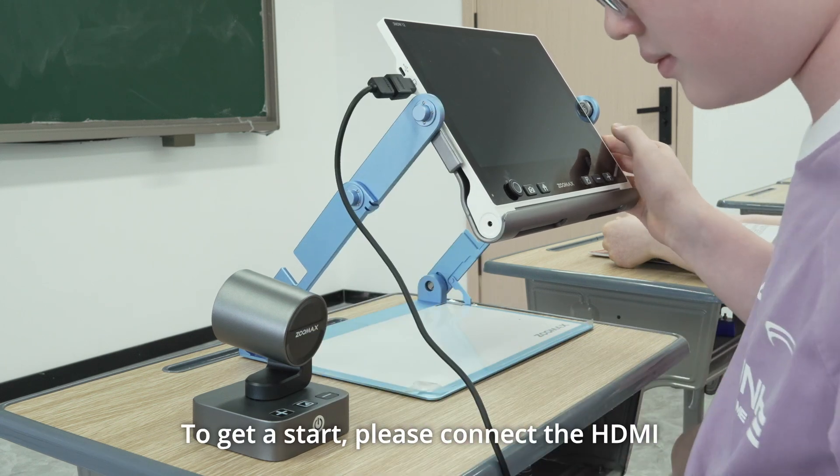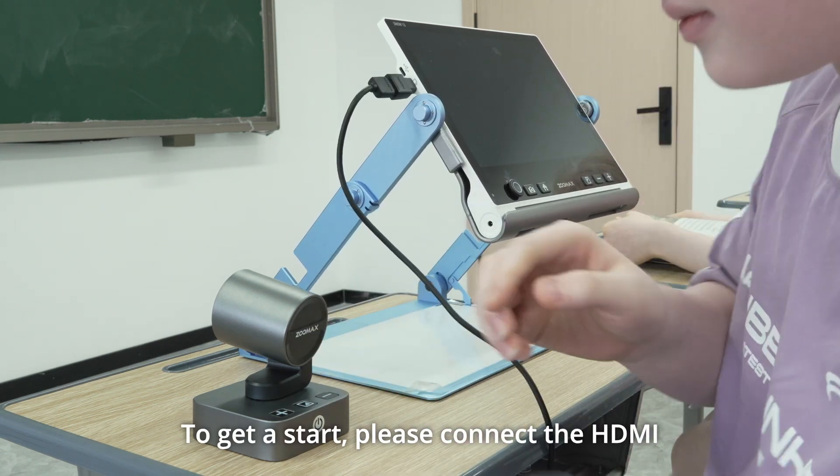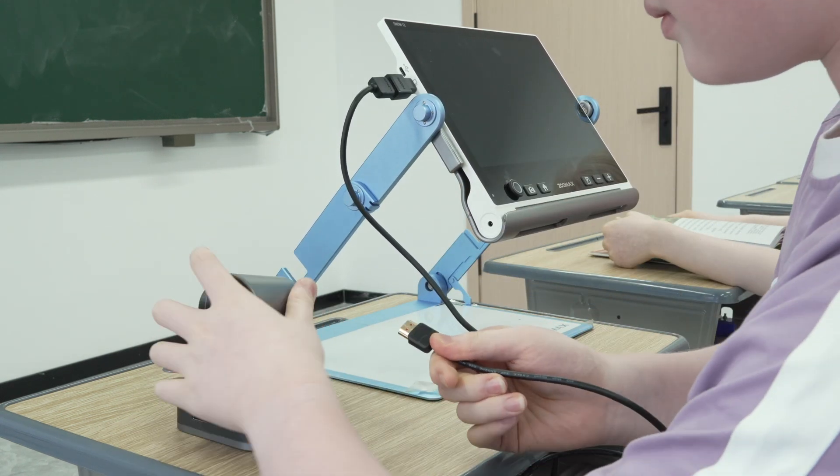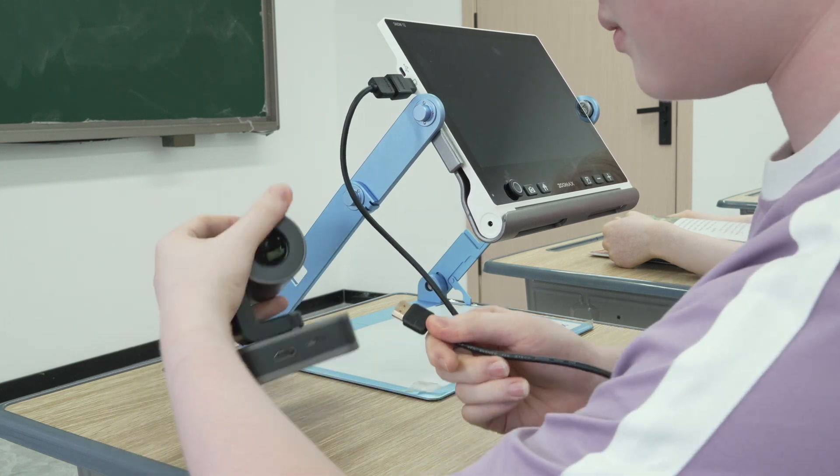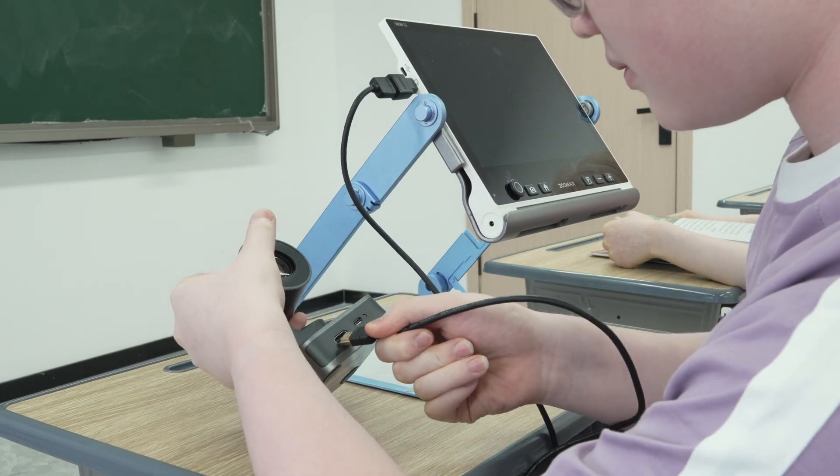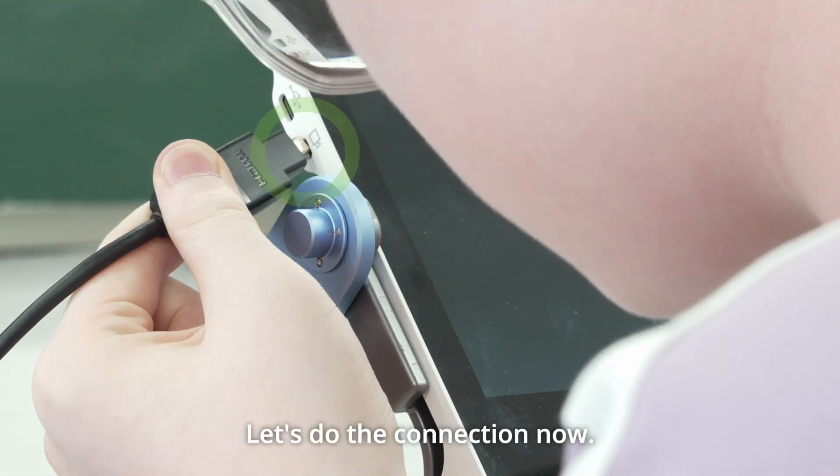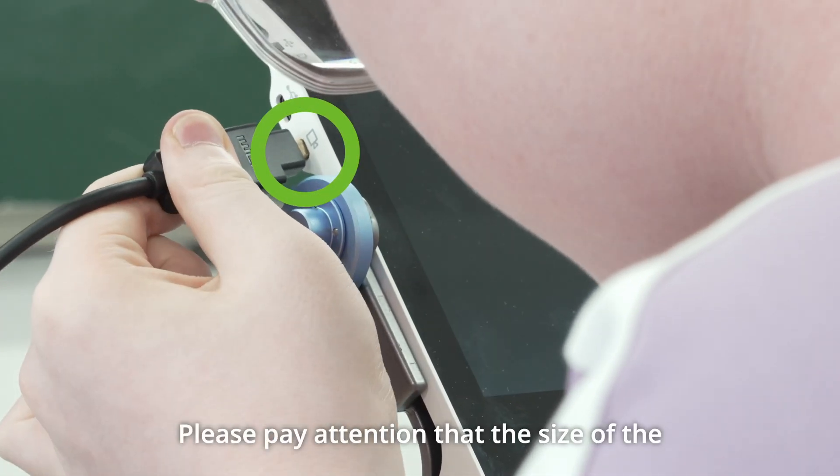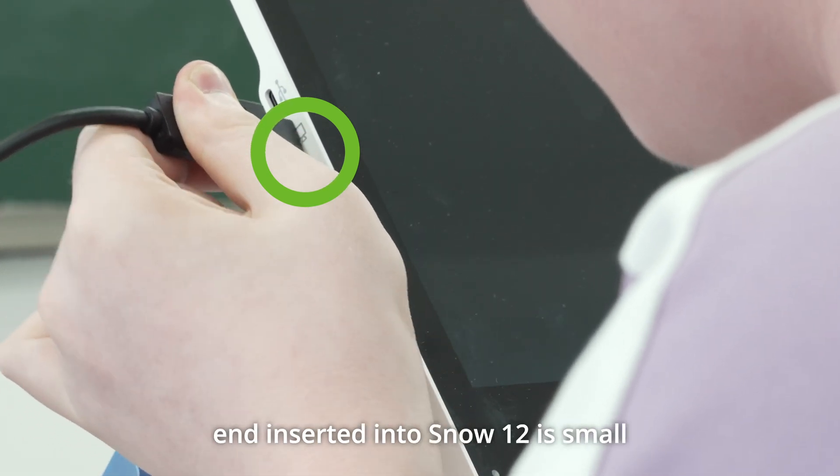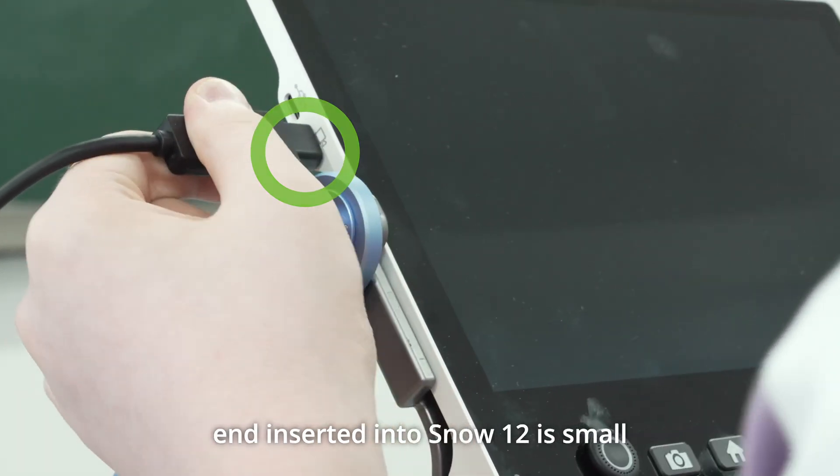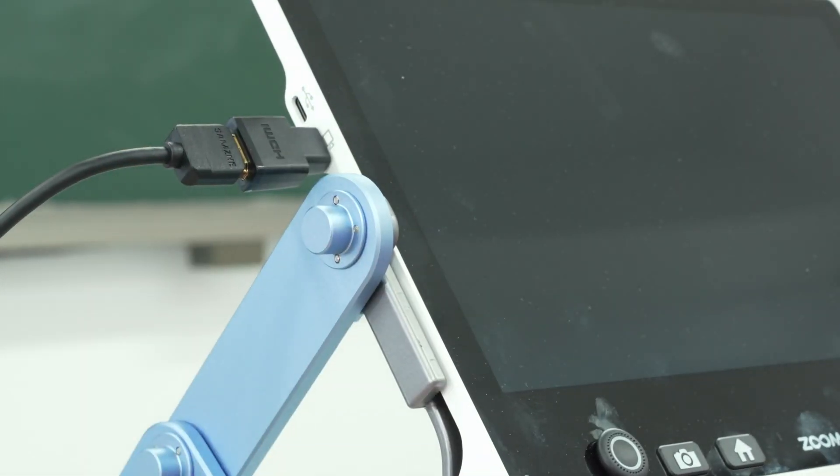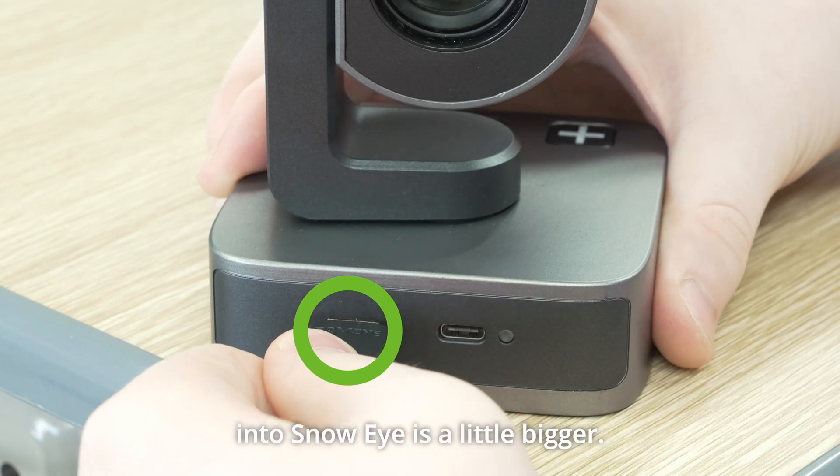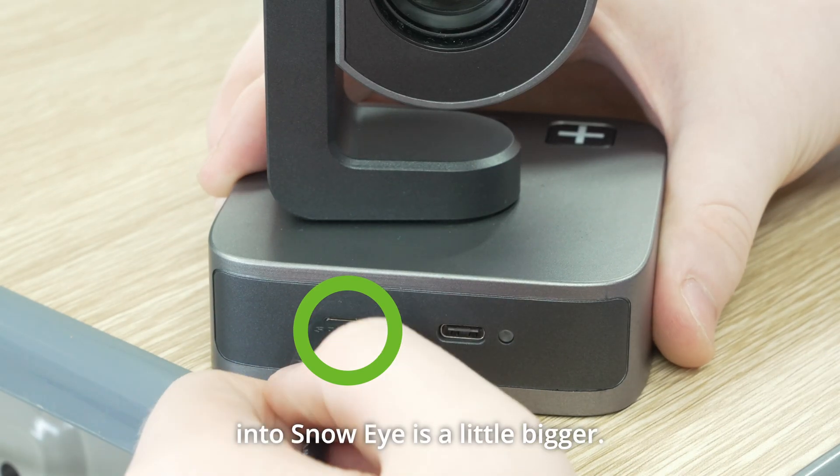To get a start, please connect the HDMI cable and the converter. Let's do the connection now. Please pay attention that the size of the end inserted into Snow 12 is small, and the other end inserted into Snow Eye is a little bigger.